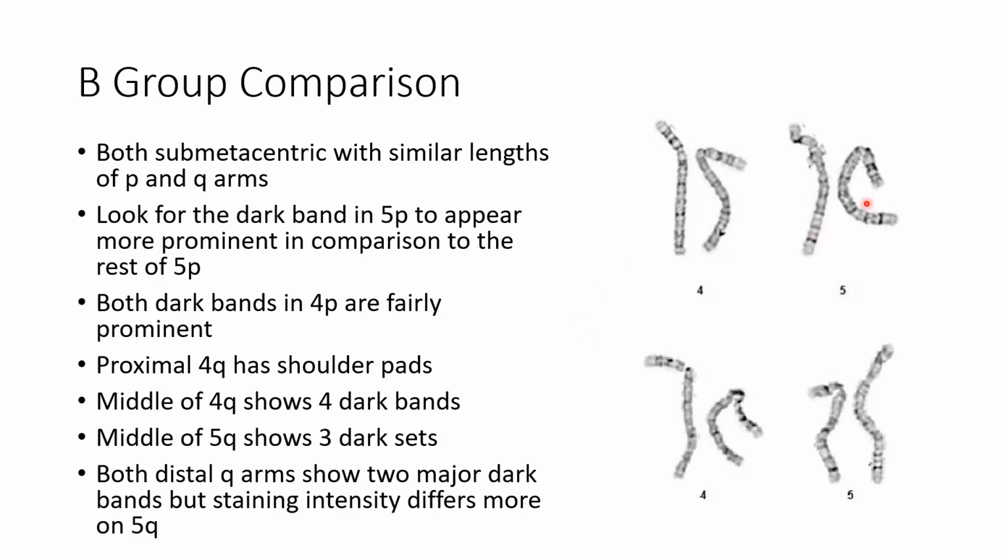I'm not sure I know exactly what you're asking, but the centromere, on the higher resolution, thinner chromosomes, sometimes it is hard to see where there's a constriction, but you definitely want to look for the constriction. And as you look at more chromosomes, it's going to be fairly obvious where it is. But this is the centromere right here for 4, and this is the centromere right here for 5. So you can see on these, you can kind of see a gap.